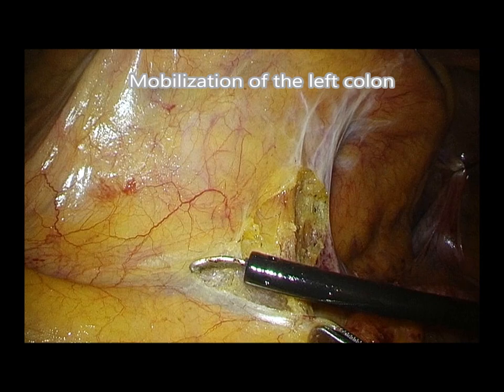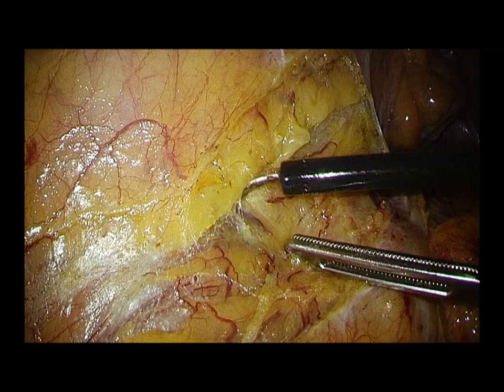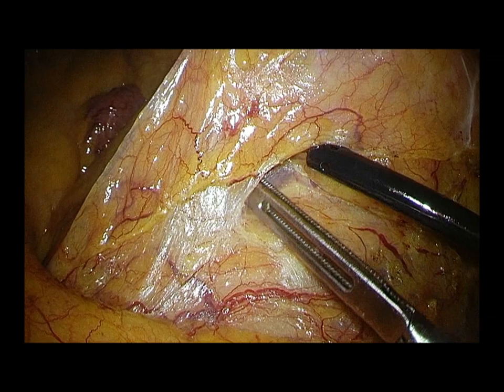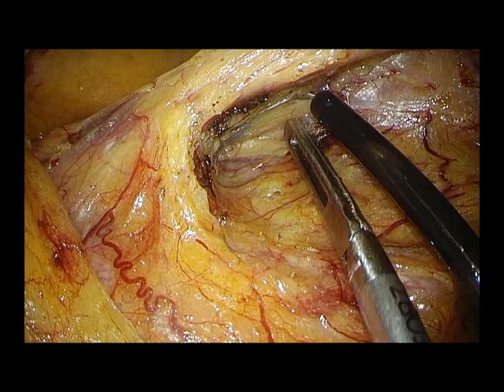The first part of the procedure is mobilization of the left colon. The layer of superior hypogastric plexus is carefully preserved. The avascular layer between the mesocolon and the retroperitoneum is precisely separated.